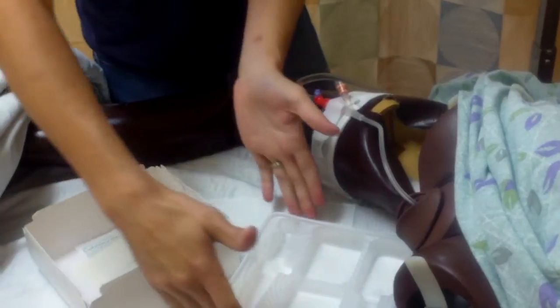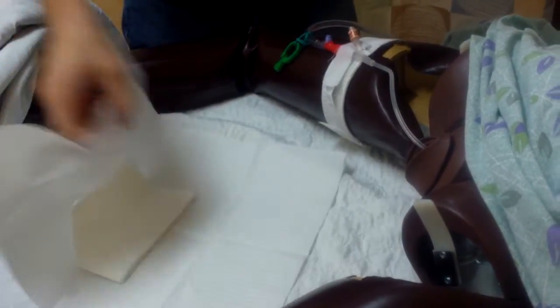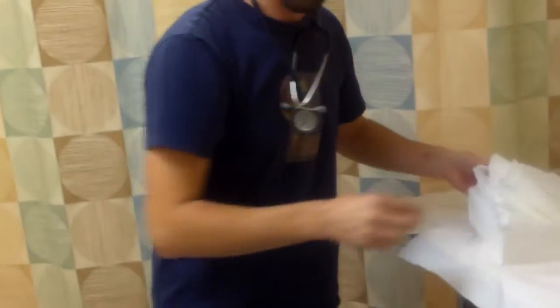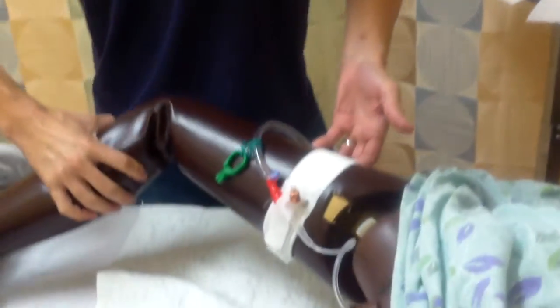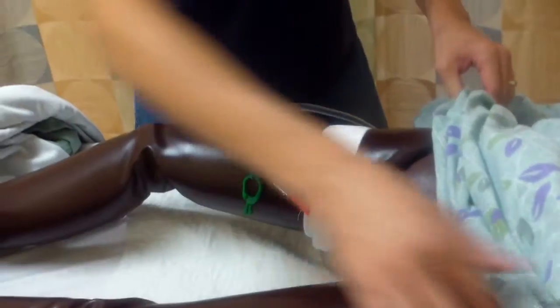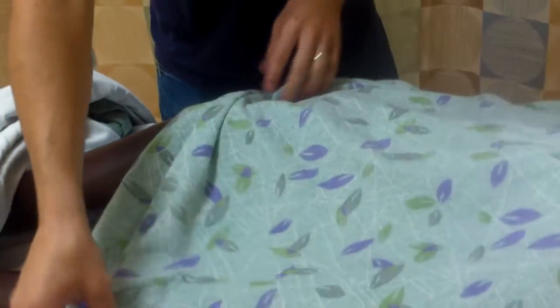I'm going to do some more hand hygiene. All right, and I'm going to see how well the patient tolerated the procedure. I'm going to clean up my mess. Okay. And then I'm also going to see how the patient tolerated it. I'm going to document the size of the catheter. I'm also going to reposition her, make sure that she's comfortable. Notice that the Foley catheter is running, and make sure that she has relief from her distended bladder.